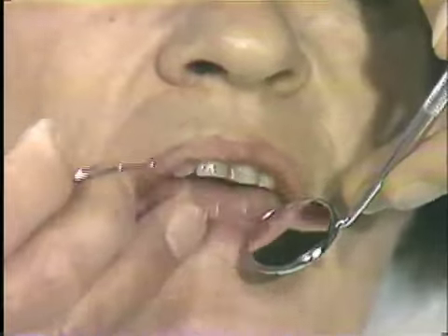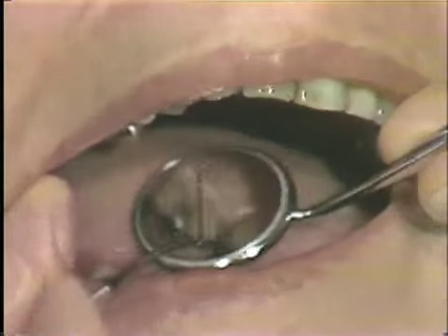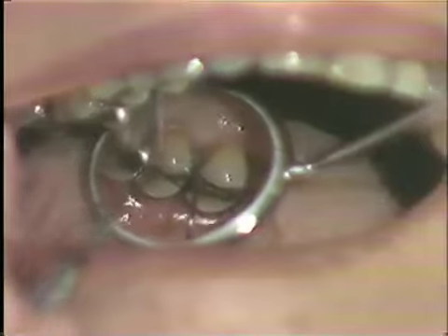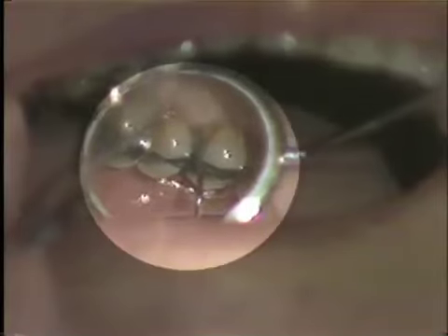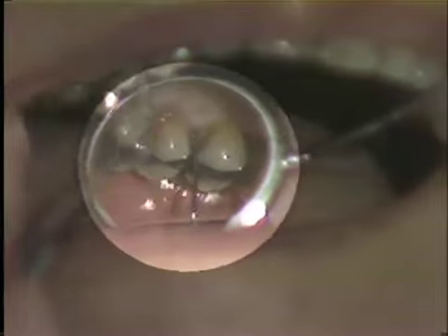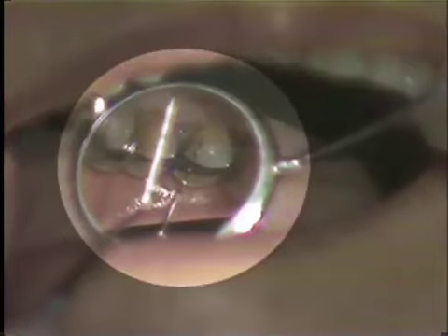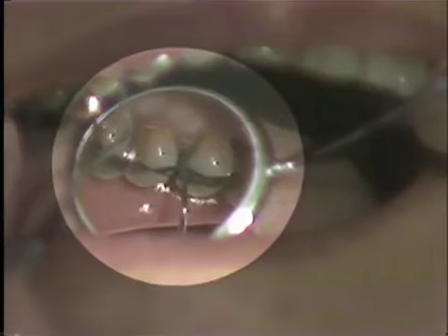Let's go to the lingual aspect of these same teeth and insert the probe here. And we can see that on insertion in this area, we go to a point that is above the 3 millimeter mark. You notice the mark that is showing as the probe is totally inserted.